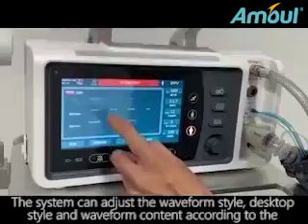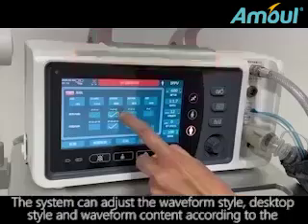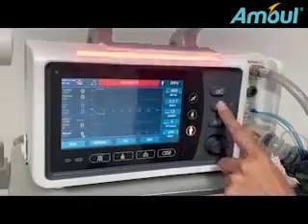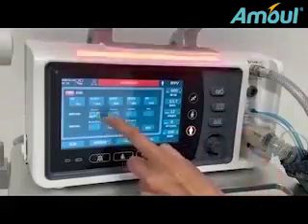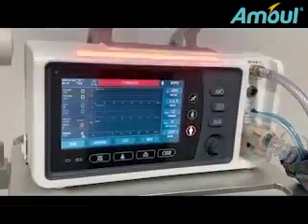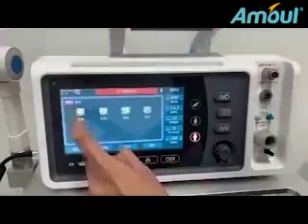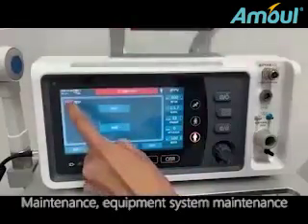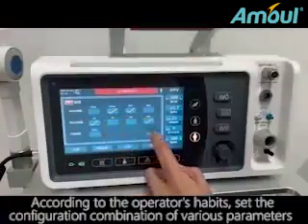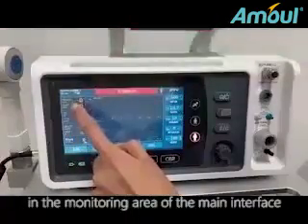The system can adjust the waveform style, desktop style, and waveform content according to the operator's habits. Different waveform combinations can be selected to be displayed on the current desktop. Time: main interface time setting. Maintenance: equipment system maintenance. Configuration: according to the operator's habits, set the configuration combination of various parameters in the monitoring area of the main interface.